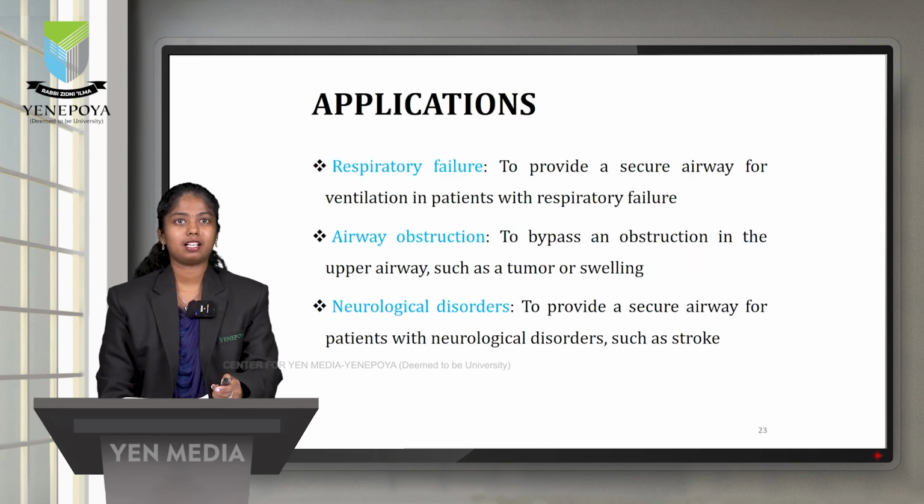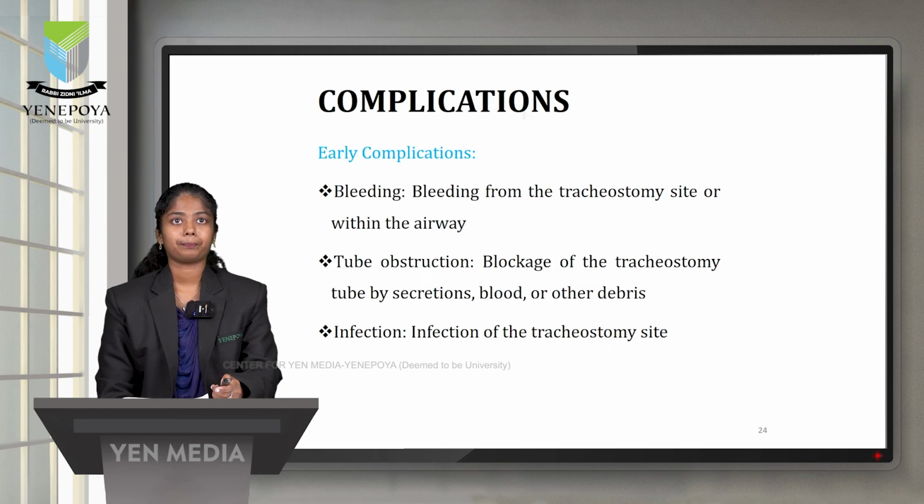And applications: respiratory failure, to provide a secure airway for ventilation in patients with respiratory failure. Airway obstruction, to bypass an obstruction in the upper airway such as tumor or swelling. Neurologic disorders, to provide a secure airway for patients with neurologic disorders such as stroke.